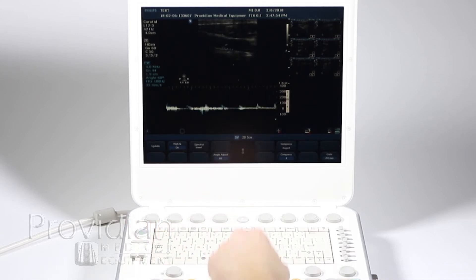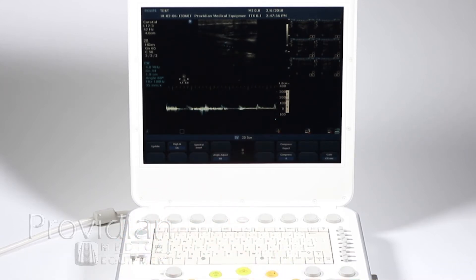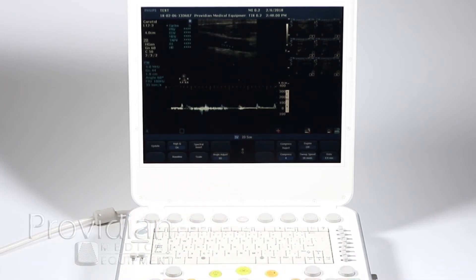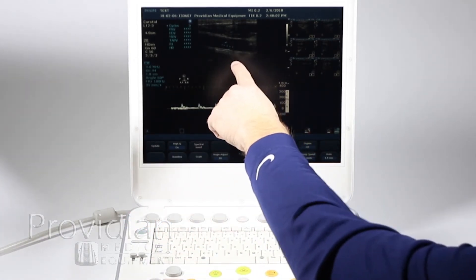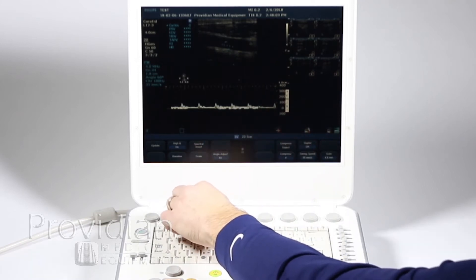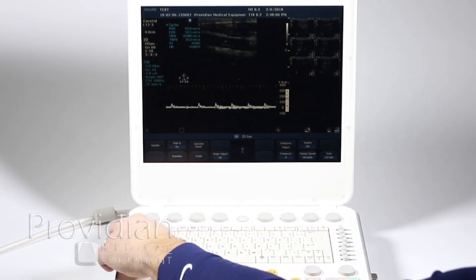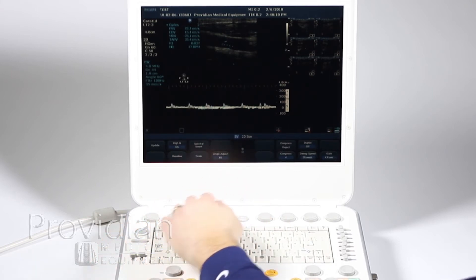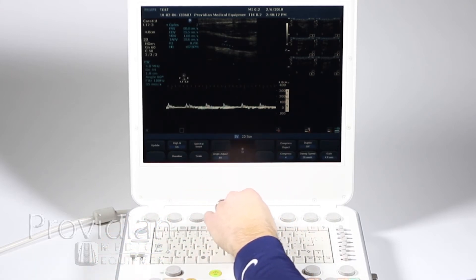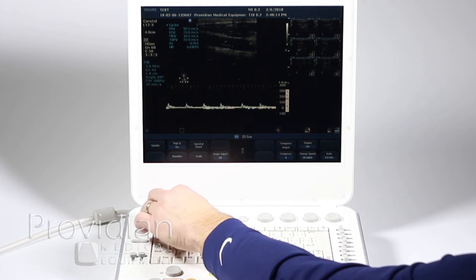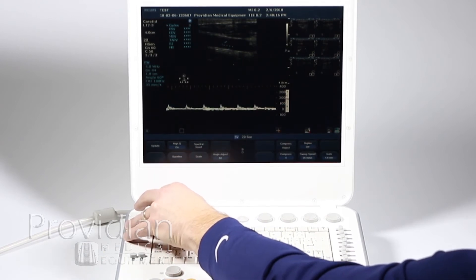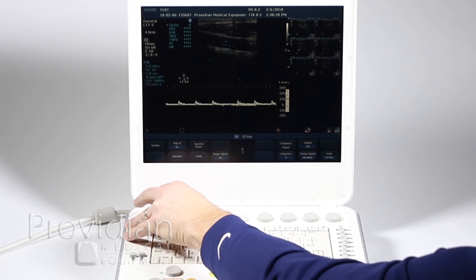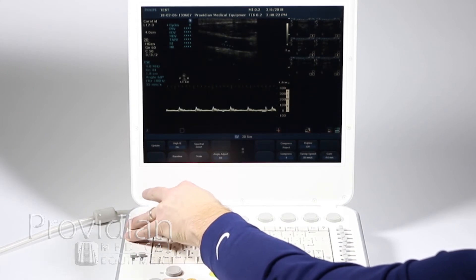Let me hit update to get that 2D image back. So I clicked update and I have my 2D image live, then I'll click update again. I can turn down the volume over here with this rocker switch. Let me adjust my baseline to something a little more normal, and then change my scale.